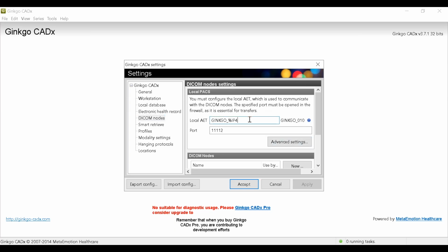So notice here, this is Ginkgo, and then it's got this funny IPv4 thing. It's a programming thing saying the last bit of my IP. Notice here it's got IP4. If I change it to IP1, it turns to my first bit of my IP. And if I just did IP, I wonder if it would. Yes, it does. It just gives me the whole name of my IP, and I'm not going to do this. I'm going to go ahead and go just with Ginkgo. It's almost like I knew it would do that, isn't it?